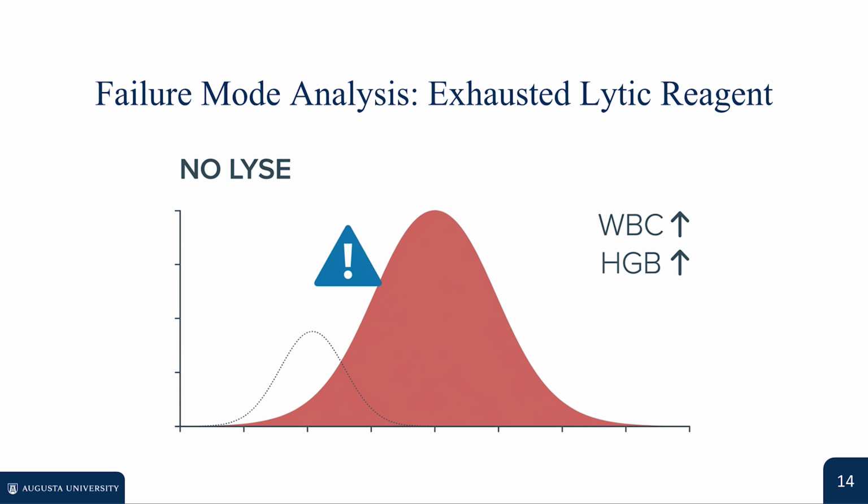Simultaneously, in the spectrophotometric chamber, intact unlysed erythrocytes scatter light and create severe turbidity, driving absorbance to maximum levels. This produces a falsely skyrocketing hemoglobin value above 25 grams per deciliter, leading to catastrophic rule of threes failure and an impossible MCHC exceeding 50 grams per deciliter.